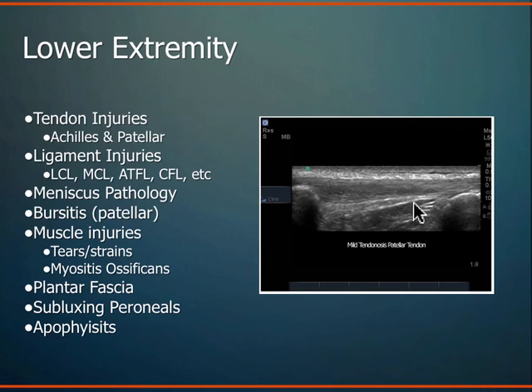This is that retropatellar area where you have the fat pad and a bursa, and you can see the anatomy quite well. You can see LCL quite well. You can see MCL quite well. You can't see ACL, PCL. Again, limitations of your modality and knowing what you can use it for. But you can see it for meniscus.